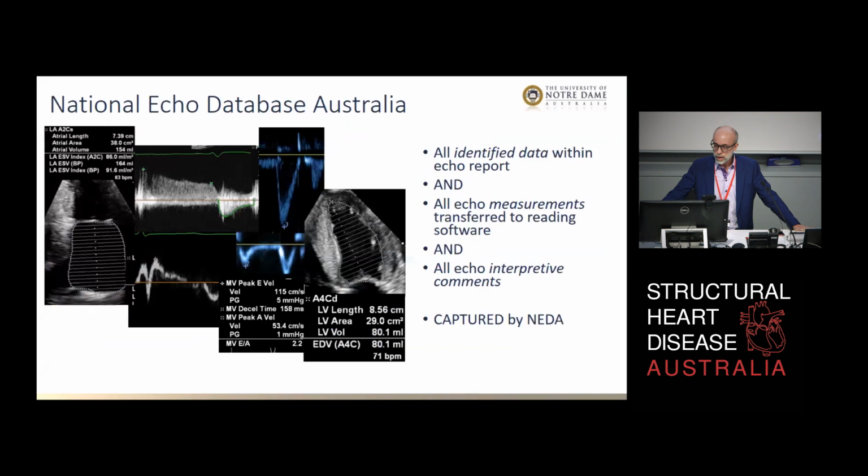Well, we take all identified data. So we include patient names in this, and the reason we do that is so we can link with mortality. And that's a really key part of this. We also take every echo measurement. So every single measurement that's performed in the echo exam and is transferred to the reading software. And we also take all of the interpretive comments. So whatever the echocardiographer and cardiologist felt was present in that echo is captured by NEDA.